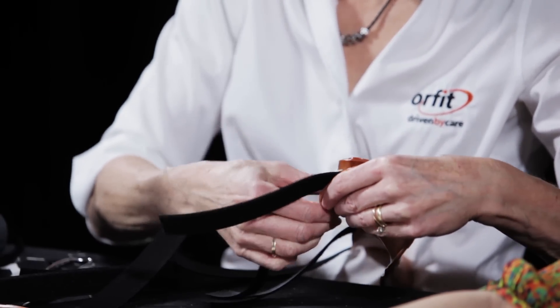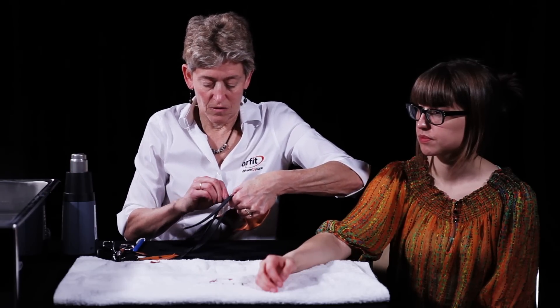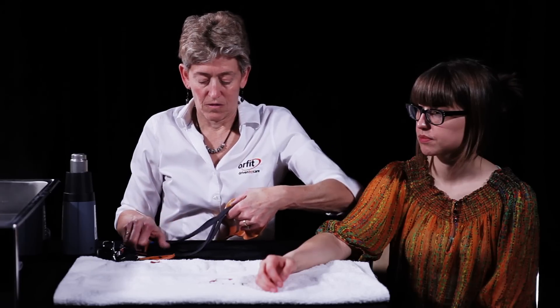Heat a small scrap of thermoplastic material with the heat gun until melted and press into the hole of the Velcro loop strap for a decorative button.